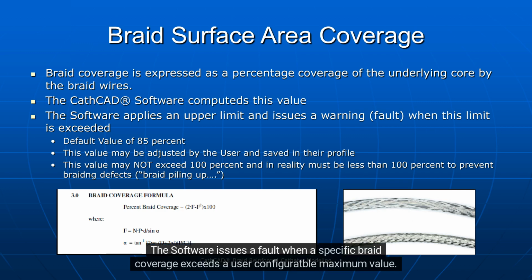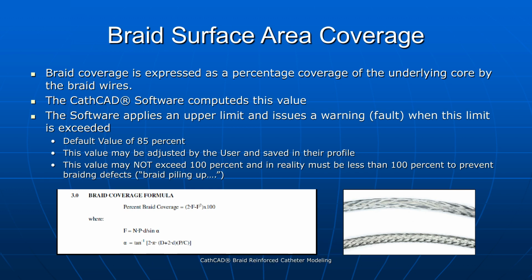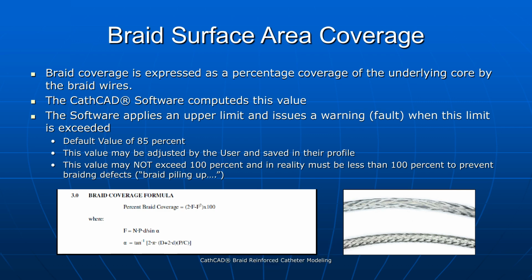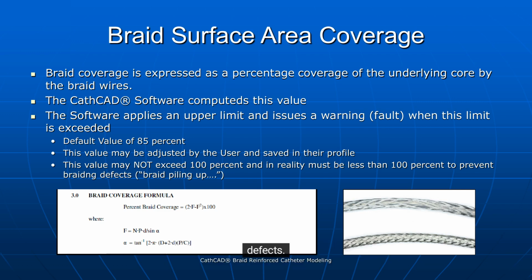The software issues a fault when a specific braid coverage exceeds a user configurable maximum value. The default value for the allowed maximum braid coverage is 85%. This value may be adjusted by the user and saved in their profile. This value may not exceed 100% and in reality must be less some reasonable value to prevent braiding defects.